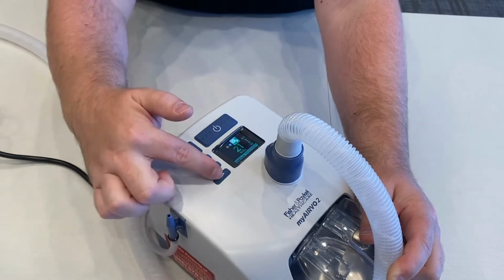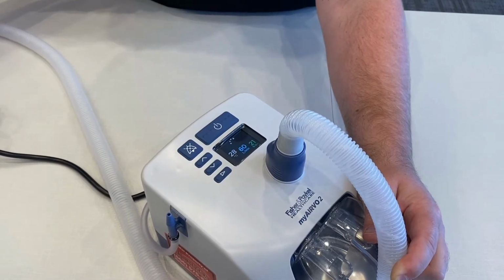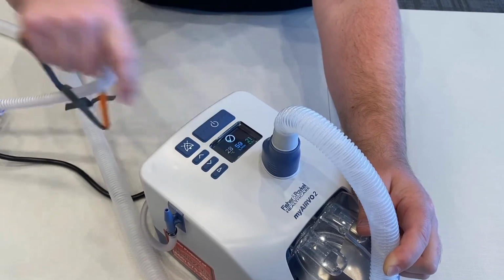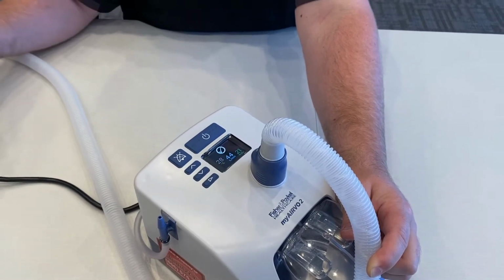To go back to the main menu, you just hit play, and it'll show you everything that's being provided to the patient. Once we reach all the desired settings, you'll see this green check mark, and that's letting you know that everything is running functional and everything that was set into the machine is being provided to the patient.